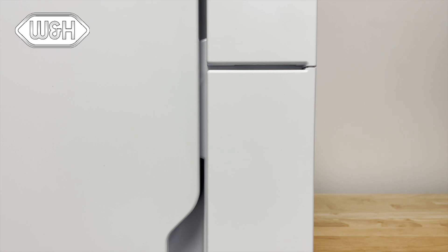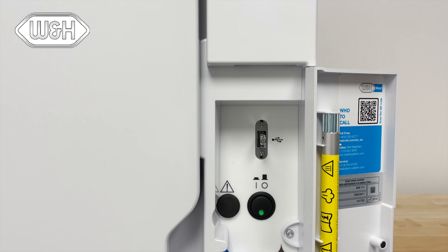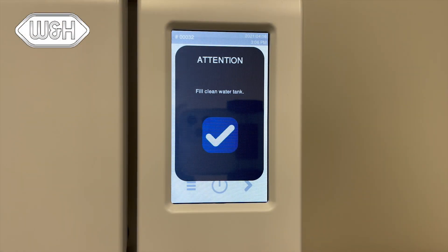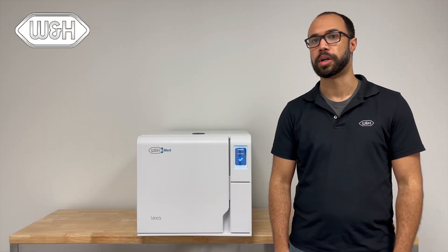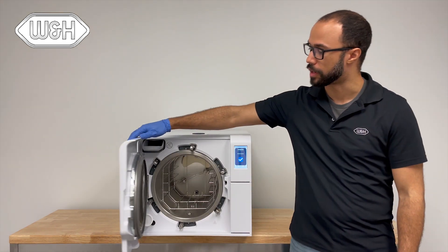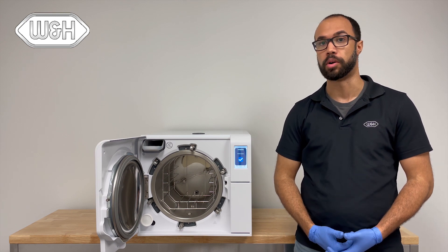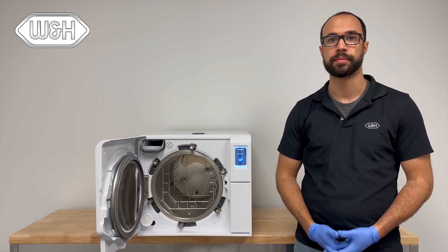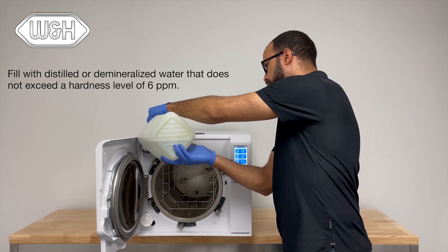To turn on the Lexus, access the front service door and push the power button to start up the unit. It takes about one minute for the Lexus to boot up. Once it boots up, you will see a notification message to fill the clean water tank. Fill the clean water tank by opening the sterilizer main door and accessing the clean water funnel in the top left of the unit. Pour clean distilled water only into the Lexus sterilizer. The clean water tank holds 1.7 gallons — fill until you hear the audible beep tone.